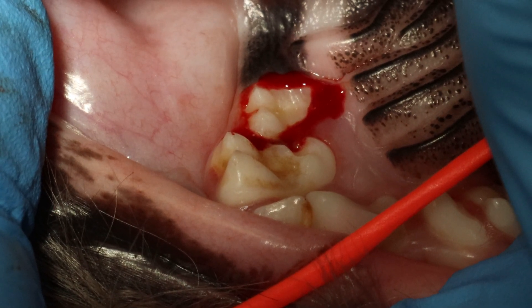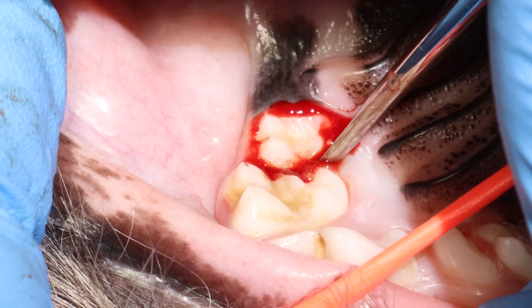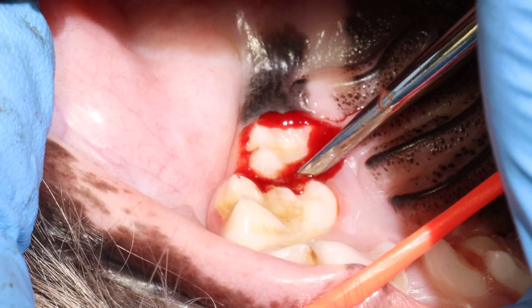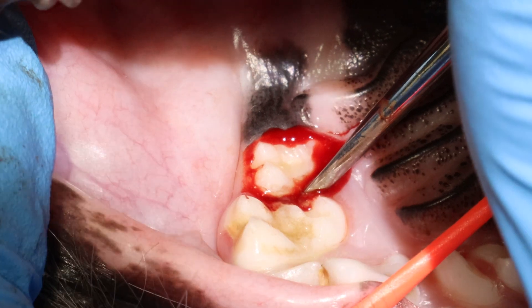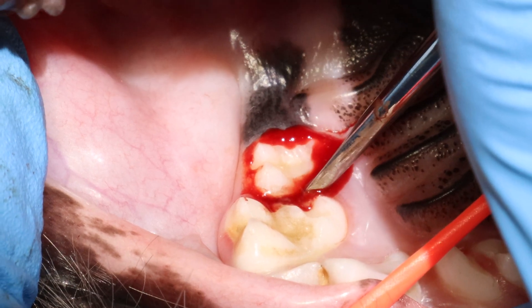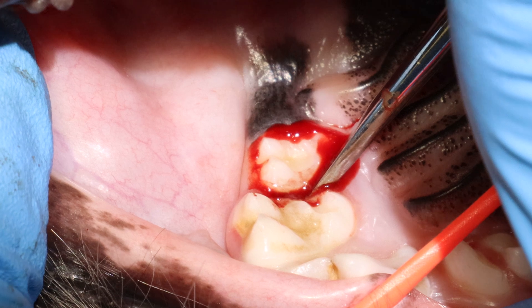For this instance, you first do the stab incisions around the tooth, and now I'm just gently putting in my luxator at this exact spot on the palatal root. This is a nice spot to begin — just put on gentle pressure. I engage the periodontal ligament, and I twist, and I hold, and I see if the tooth moves.